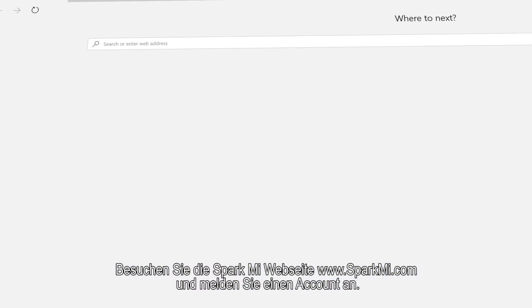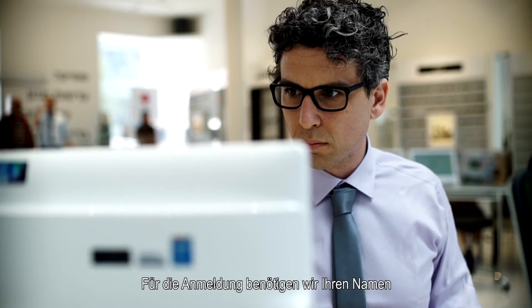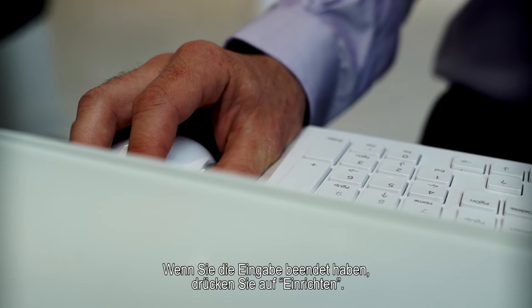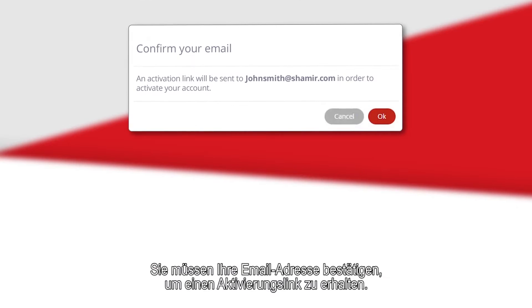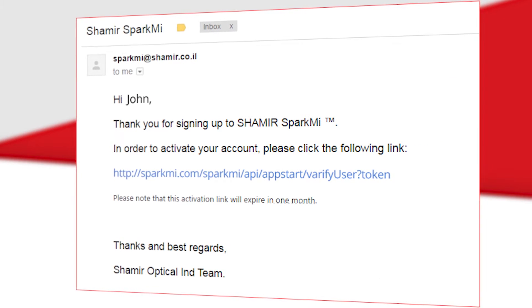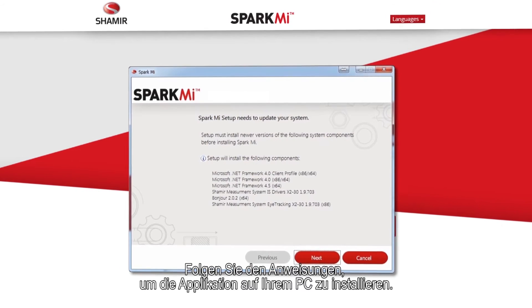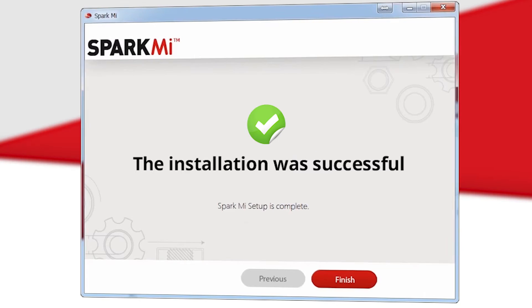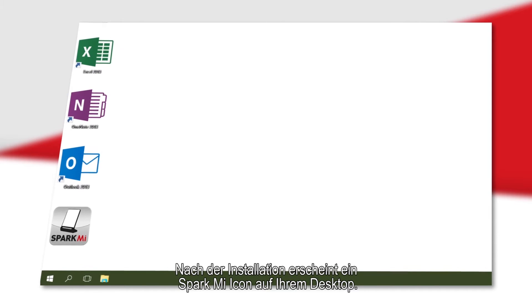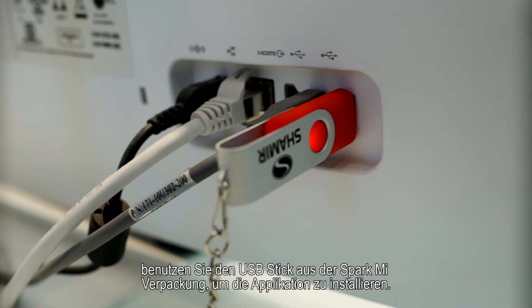Visit the Spark Mi website at www.SparkMi.com to set up an account. Register by completing a short form with your name, company name, country, and credentials, then select Submit. Confirm your email to receive an activation link, which will redirect you to a download page. Follow the instructions to install the application; a shortcut will appear on your desktop. If you do not have internet access, use the USB drive from the Spark Mi package to install the application.